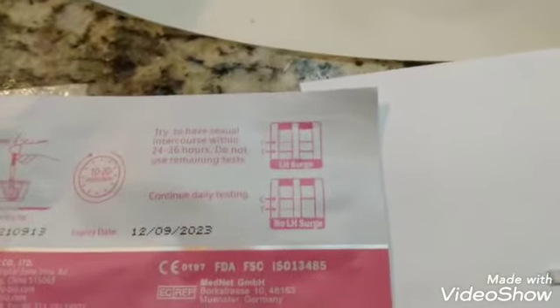I have had it where I've gotten positives for 2 days in a row sometimes, but it's usually a... Stop it! This phone keeps locking on me. Sorry, guys. It's usually the case where I have equal lines one day, then I get a darker test line the second day than the first day, and then the third day it'll go back towards negative. My surges are pretty quick.